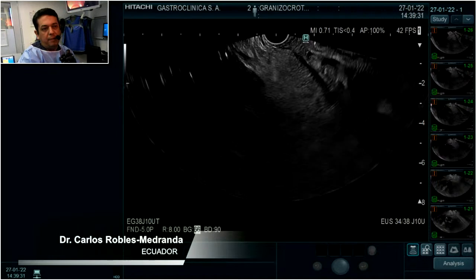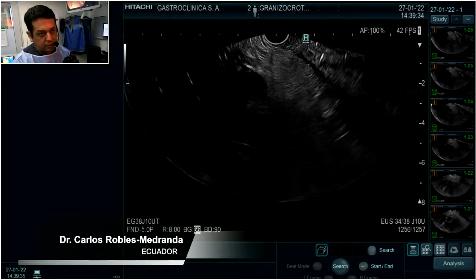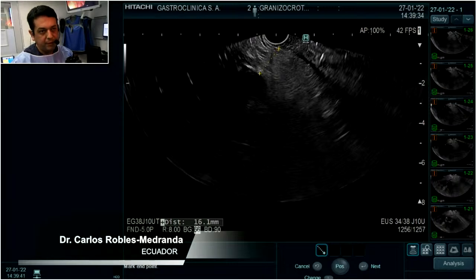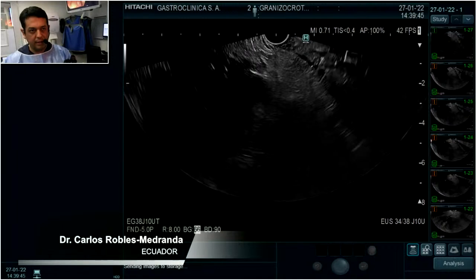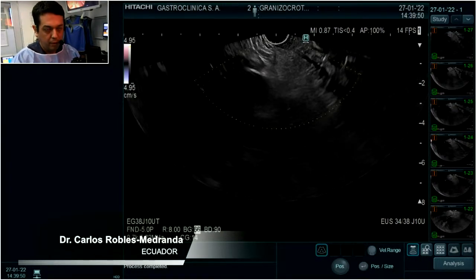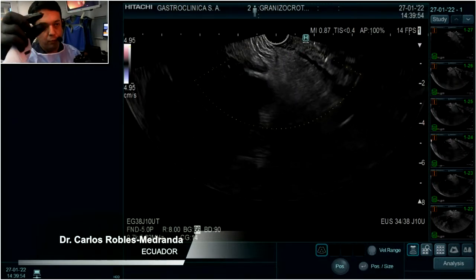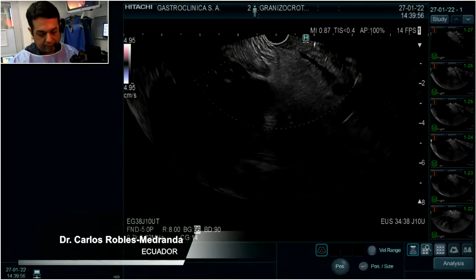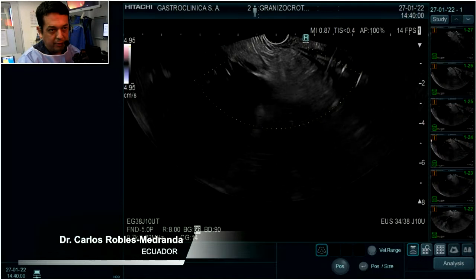Second, I believe if I can try to use an axios, okay, in spite of the distance. I have 16 millimeters. Okay, so this is the best axis that I have. So you need to see the thickness that you have to pass, and you need to search the small thickness area. This is very important.